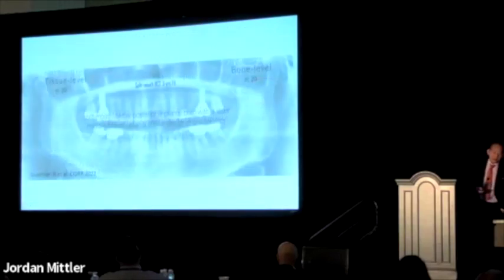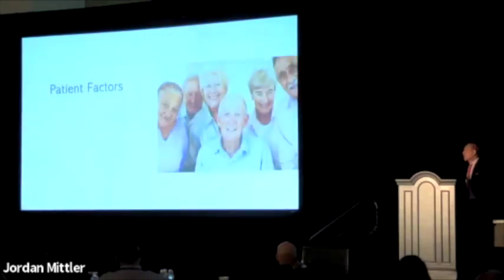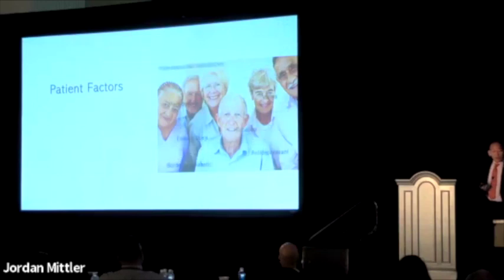And lastly, you have to remember one thing, that patients are ever evolving. A patient may come to you at 30 and be healthy, but at 50, just like we said, they start to develop disease, or at 60, they stop brushing their teeth and they have diabetes. So a lot of times you say, well, I'm going to place a tissue level implant, but only in a periodontally compromised patient, or I'm going to choose this implant versus that implant. Patients are ever evolving. So I treat patients like an orthopedic appliance. I tell them that some of you are going to need to replace within 15 years, and that I see them as ever evolving human beings.